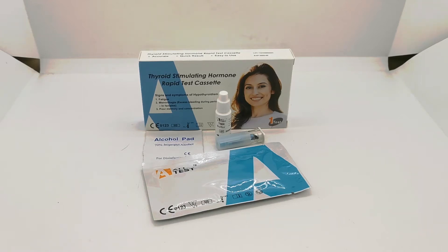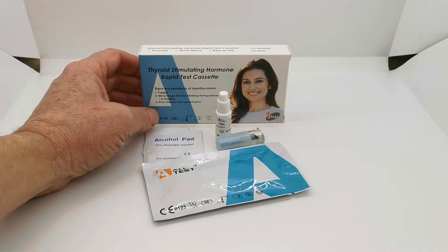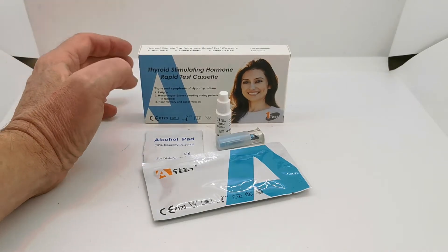Welcome to this Valumed Medical Supply product demonstration video, where we are showing you the contents of what you get if you buy one of these thyroid stimulating hormone or TSH test kits from us. This is a self-test kit, it's CE marked for home or self-testing and allows you to determine whether or not you have a normally active thyroid gland.